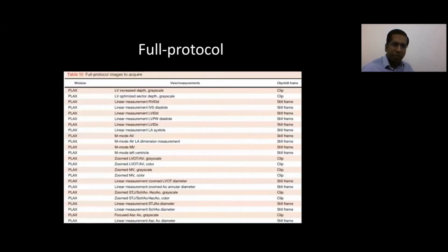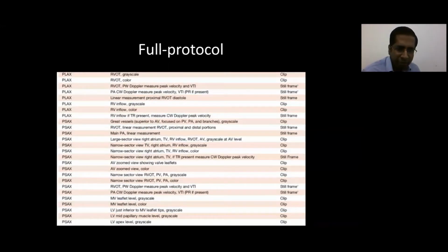Now, the idea of putting this is not to take you through each thing, because all of these things I have demonstrated and shown today. But this is part of the ASE guidelines and the protocol. So when we say protocol, these are all the different things that we go through. All of these things have been shown today. Nothing extra has been shown, just so that we stay focused and in line with what has been mentioned.